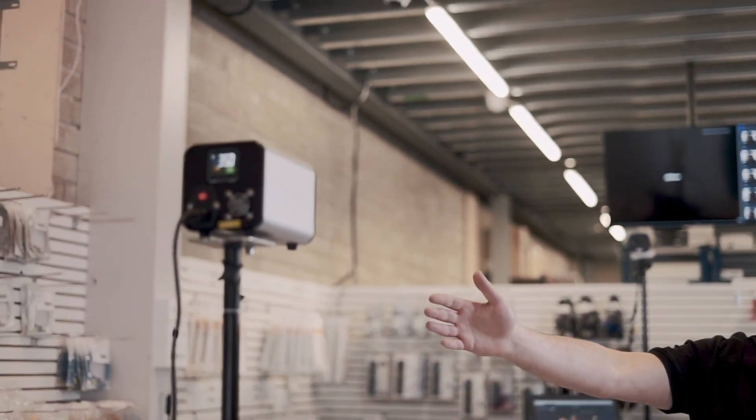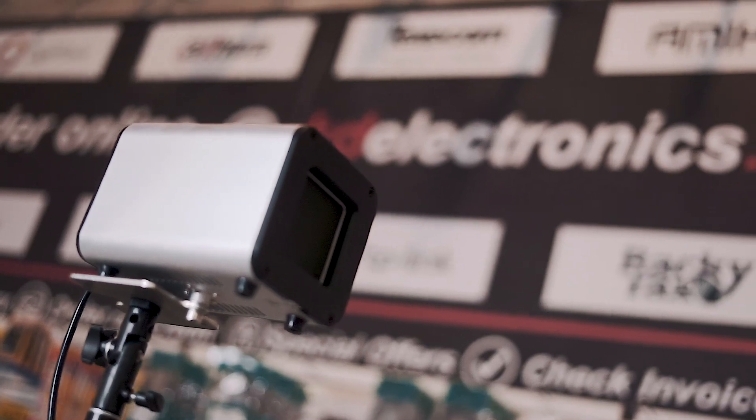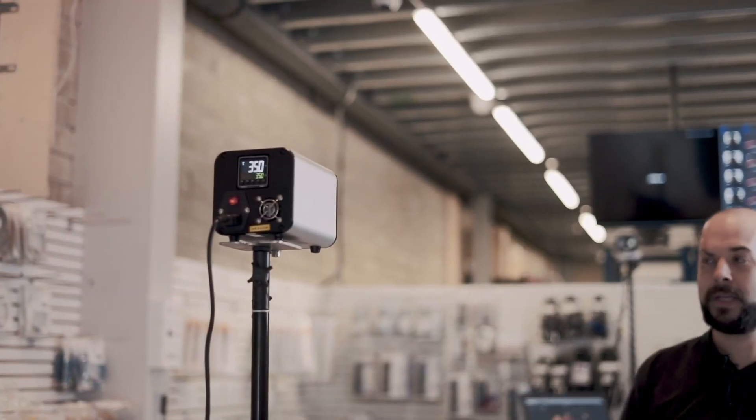The second part to the system is this unit over here called the black body. It outputs a steady temperature reference point to the camera, which allows the system to have an accuracy down to 0.3 of a degree. Next, we're going to show the system in operation.